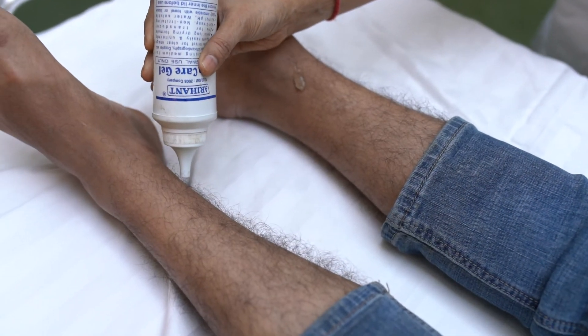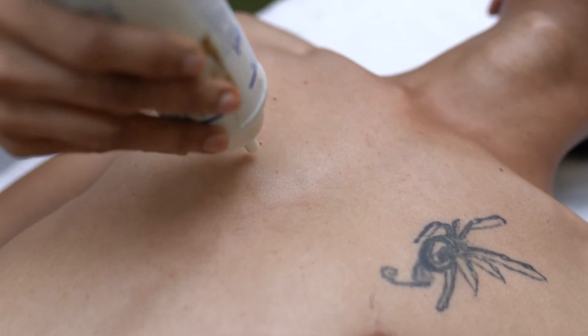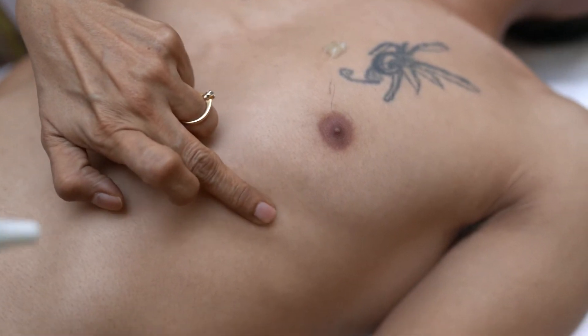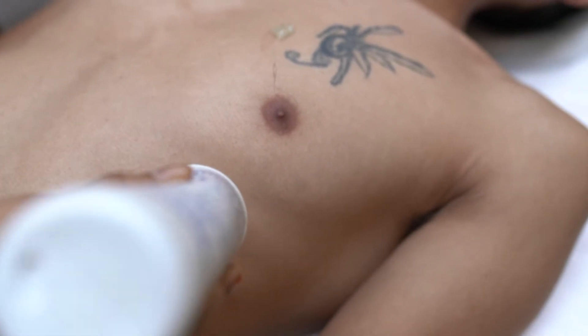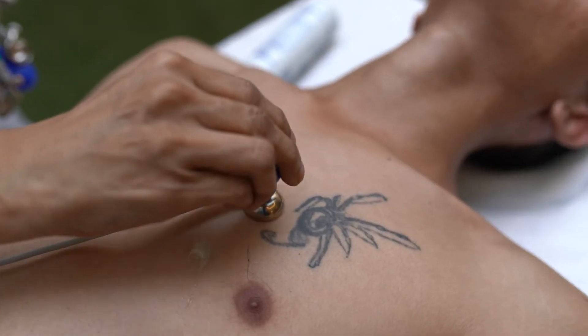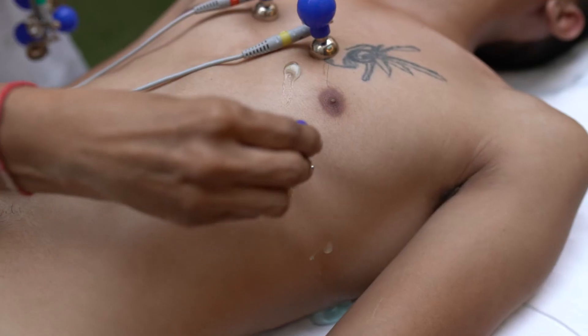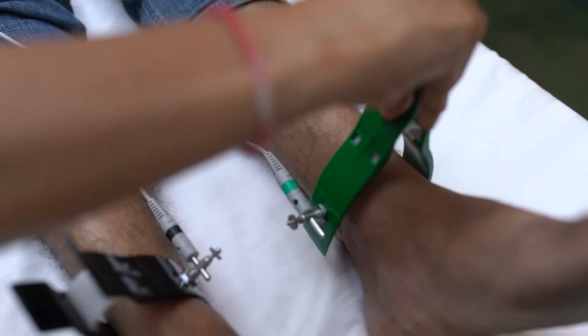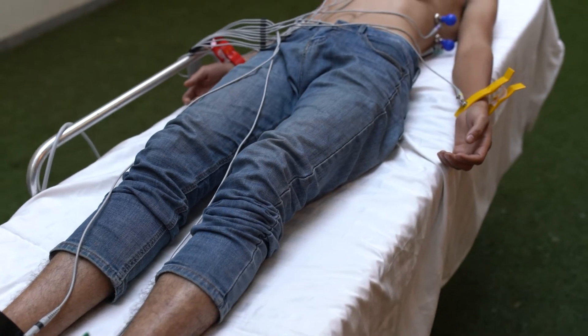Begin by applying ECG jelly on the electrodes of the ECG clamps. Also, apply the jelly on the 6 chest lead locations on the patient's body. Apply the chest bulbs on the corresponding location on the patient's chest. If you are not sure about the placement locations, please visit the 12-lead electrode placement segment for a quick recap.